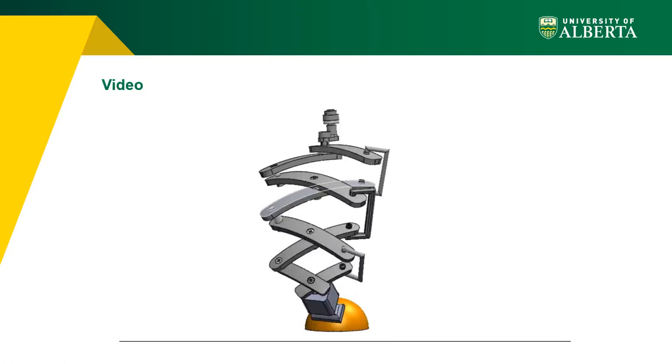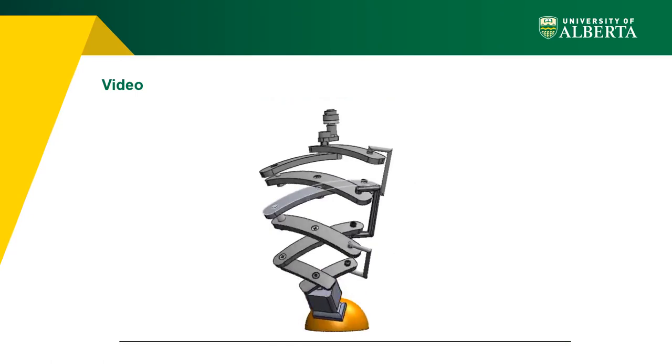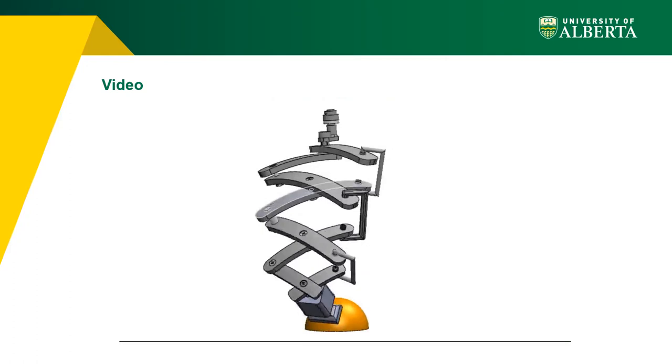A video is presented to show the mechanism's functionality. As seen, it is able to move over the surface of a hemisphere while its remote center of motion point remains at the center of the sphere. The full video is available on our YouTube channel. Thank you for your attention.